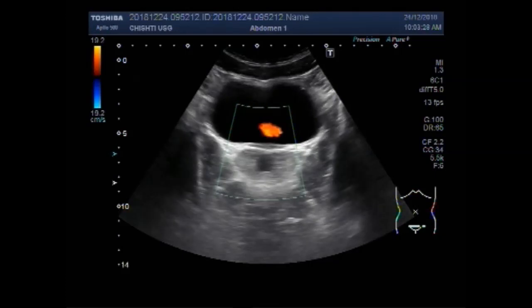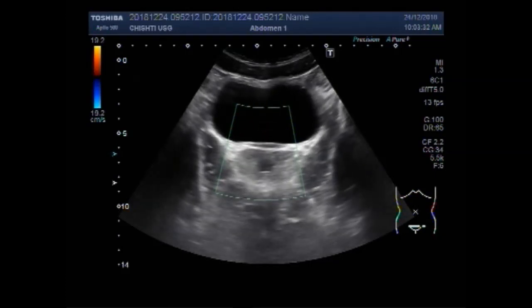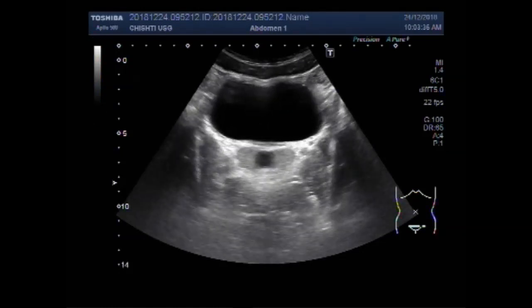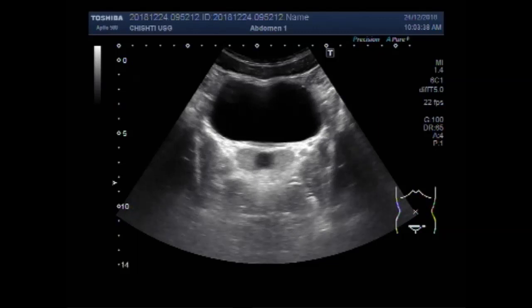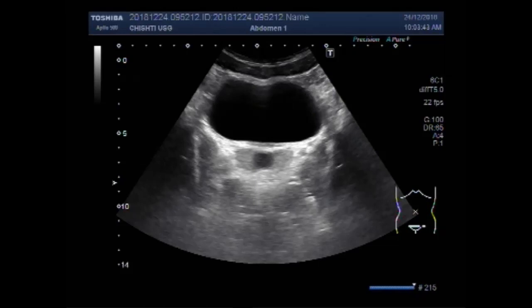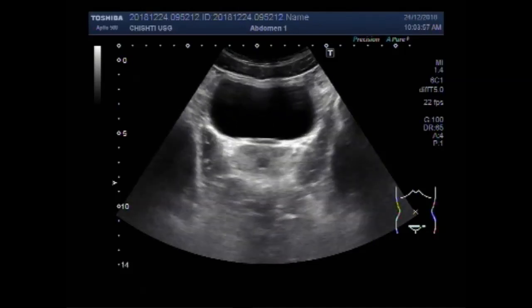You can see the Prostatic Utricle Cyst. It measures about 16.3mm.